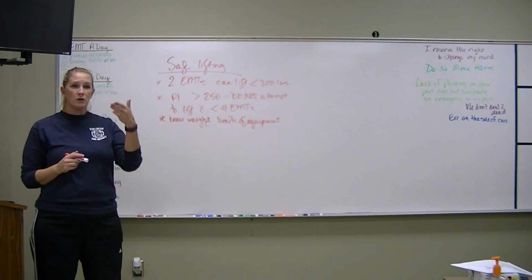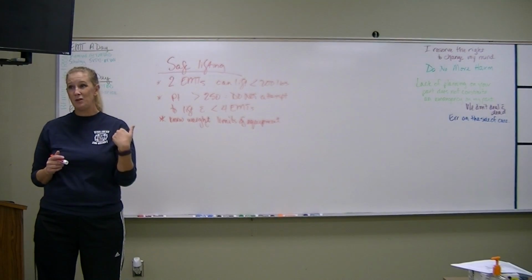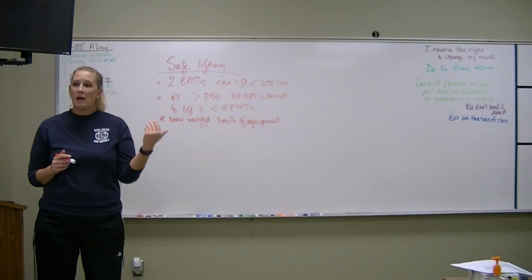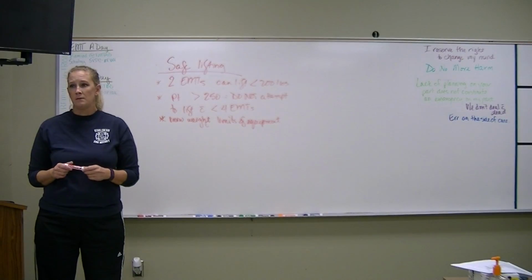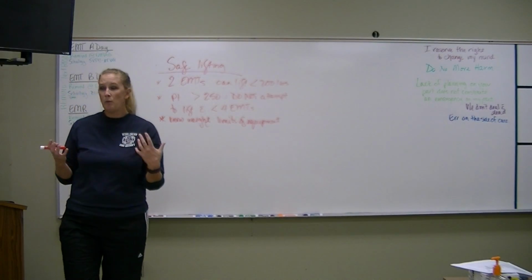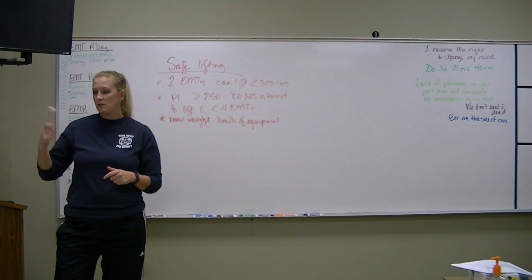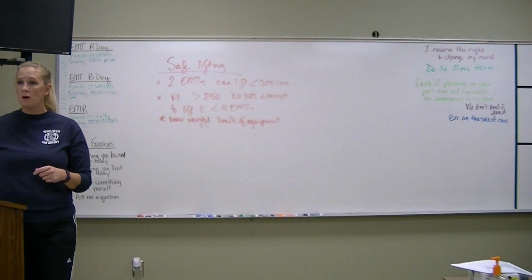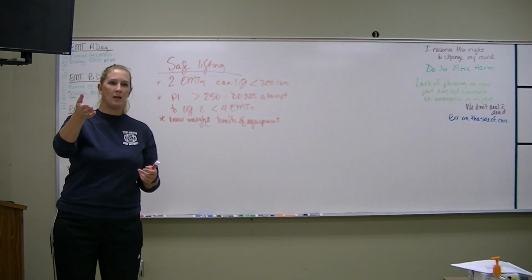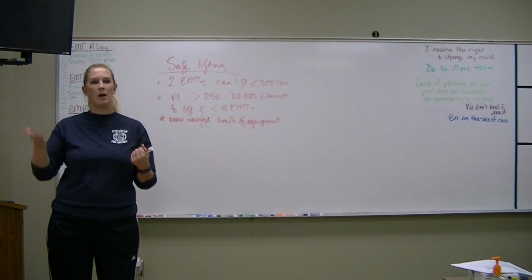So if your transport agency is Ada County, they're probably really willing to come out and show you their equipment and teach you about it. They're usually pretty good about that outreach. They like to come here and talk to my students too. They'd be willing to show you how to use their equipment. One of the stretchers in the back of our ambulance at work is a power stretcher. So you put the back of the stretcher in the back of the ambulance, you lift up on the end and push the button and the bottom raises right up.